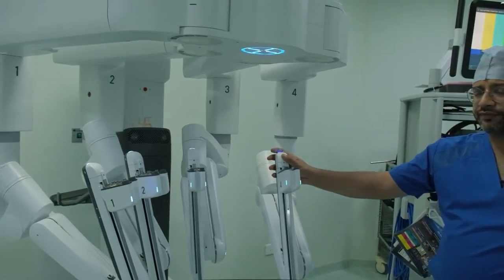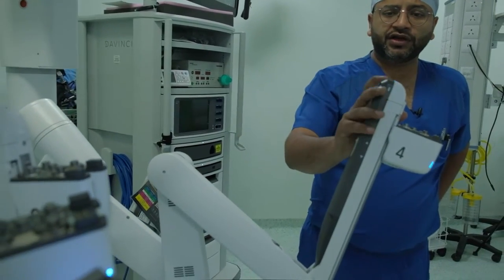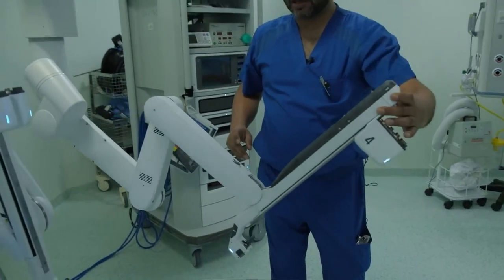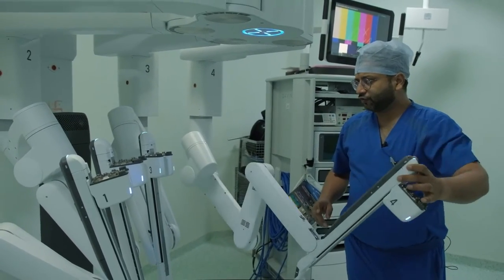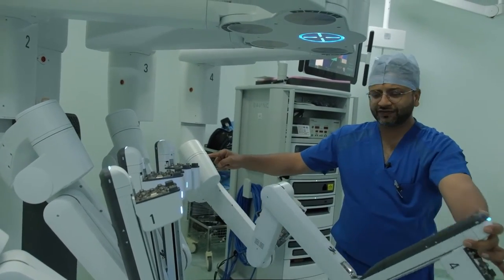These are the instrument arms, which are controlled by these buttons. This is the instrument clutch. Once you press the instrument clutch, the LED is going to blink blue, and this shows that the instrument can be moved, or the arm can be moved in any direction wanted. But it is not going to control the proximal set of joints. It is just going to control the distal set of joints.